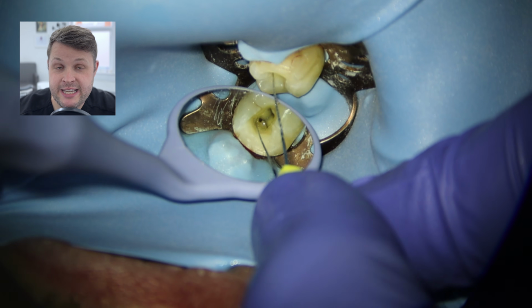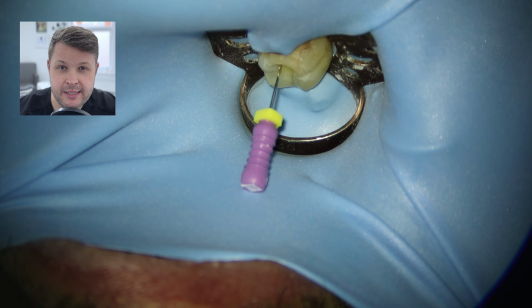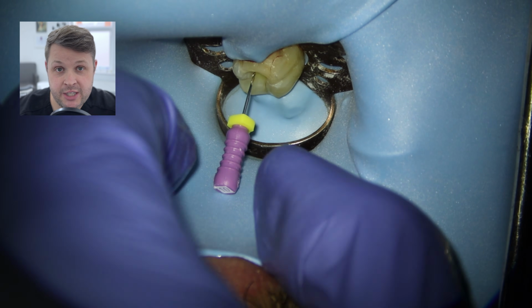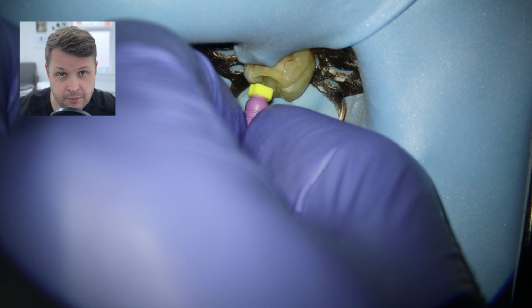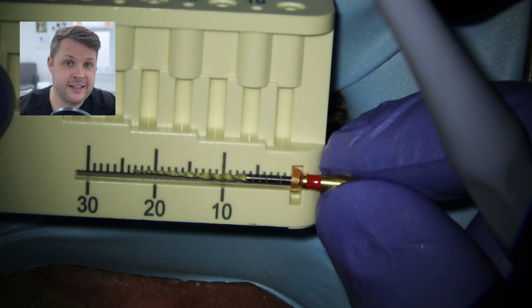Rightly or wrongly, I don't recapitulate with every single canal, but again, I'm really mindful of the sclerosed or calcified nature of this canal. Essentially what recapitulation does in this case is it just makes sure that the canal space is still open, so there's no debris down there, and you're just making sure that the canal is still patent, ready for your next rotary file.